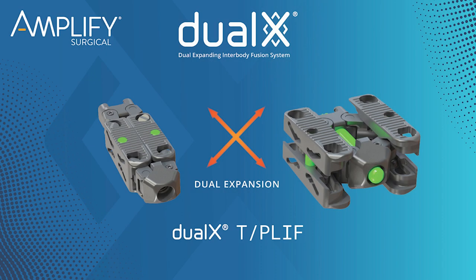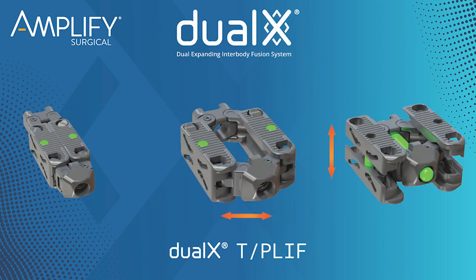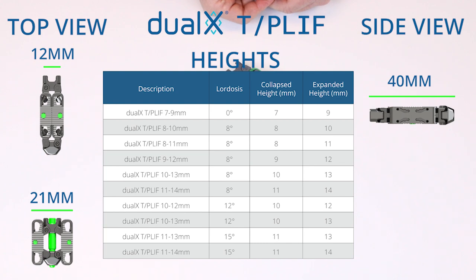The Dual-X implant expands in two directions, laterally first, then vertically. Each implant starts out at 12 millimeters wide and expands to 21 millimeters wide. It starts out at 40 millimeters long and when expanded is 25 millimeters long.